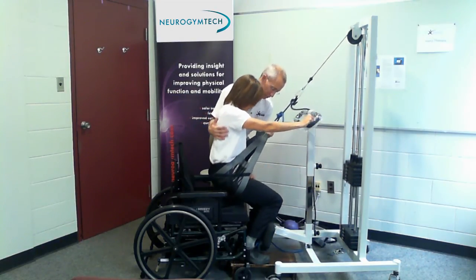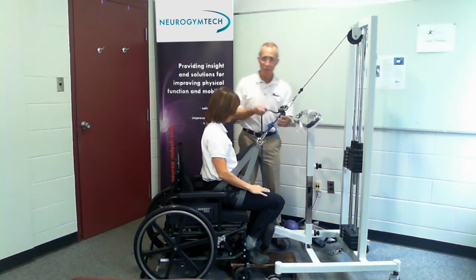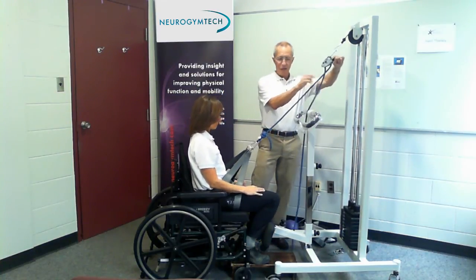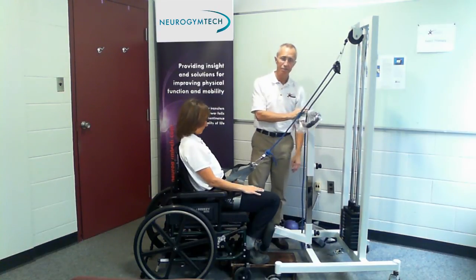And then back down. Remember when you release, you lift up on the lever, the free end of the rope goes down, and you have to have all the tension off the rope before you can change the weights.